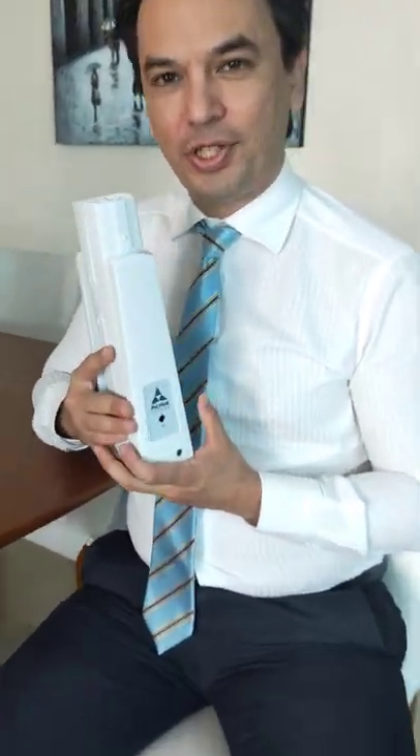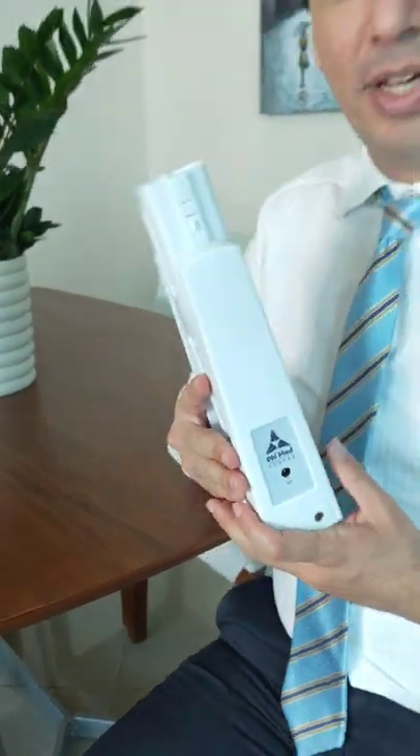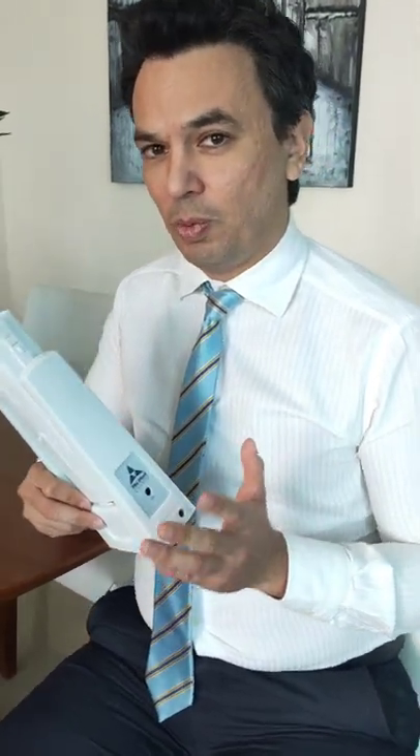Today I'm going to introduce this device which is called NerveCheck — very useful if you have diabetes. It tests for sensory loss in your feet and is recommended by the American Diabetes Association that you do this test once a year.